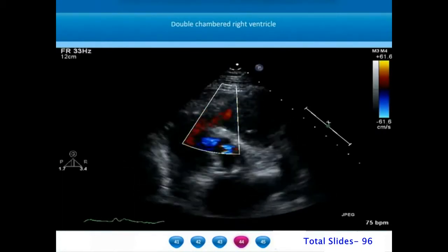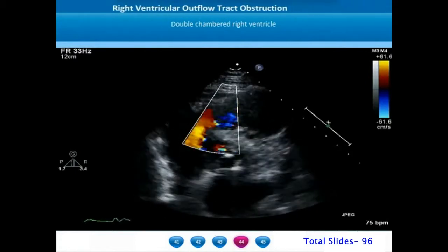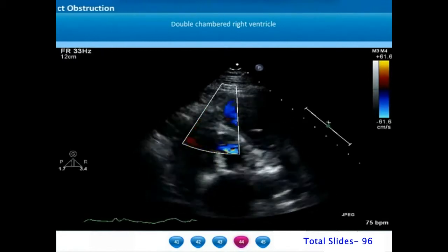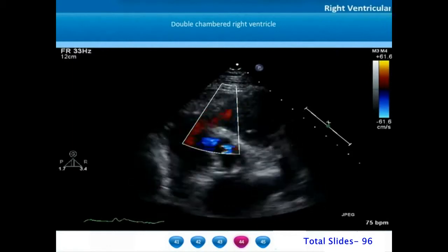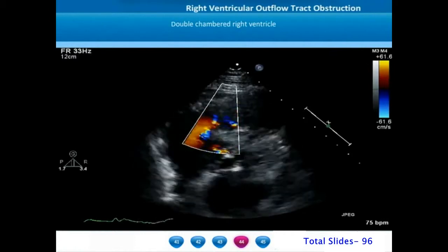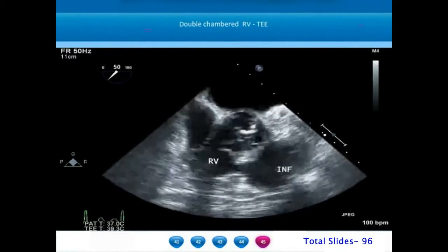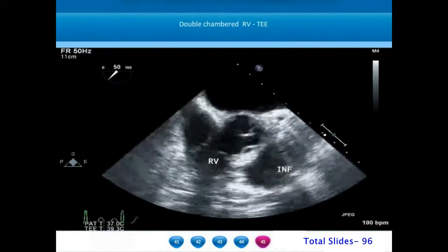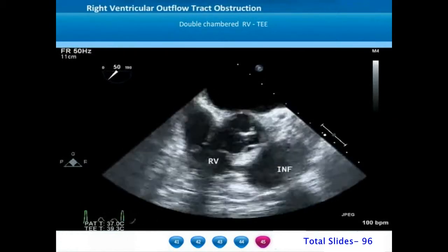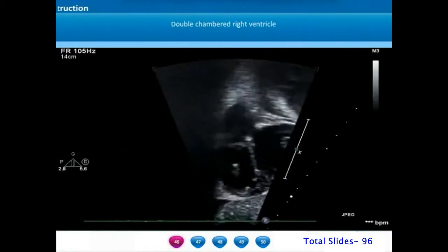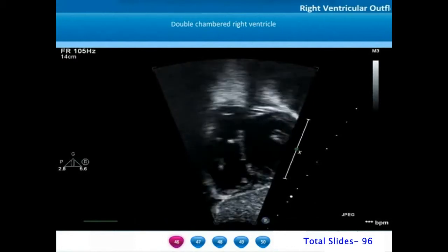Double chambered right ventricle is a morphological entity where marked hypertrophy of the septal band partitions the right ventricle into a chamber involving the right ventricular inflow and apical portion, and a chamber involving the right ventricular outflow or infundibulum. In this parasternal short axis view we can notice marked hypertrophy of the septal band causing severe sub-infundibular RVOT narrowing. On transesophageal echocardiogram, we appreciate the right ventricular inflow and outflow with sub-infundibular severe narrowing, a normal pulmonary valve, and a well-formed infundibular chamber.